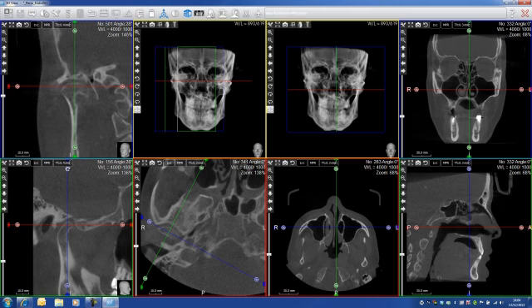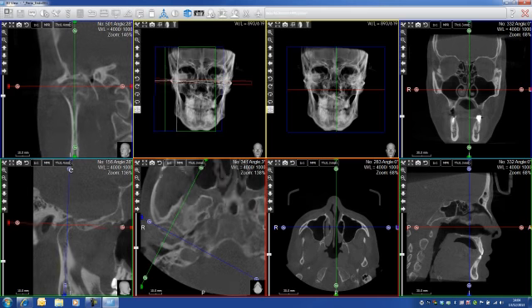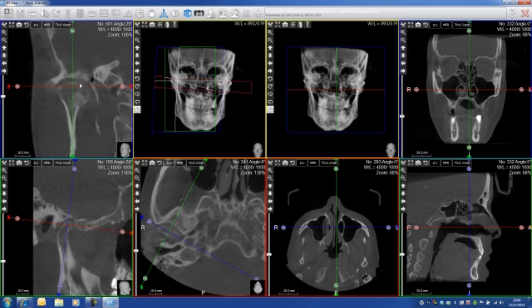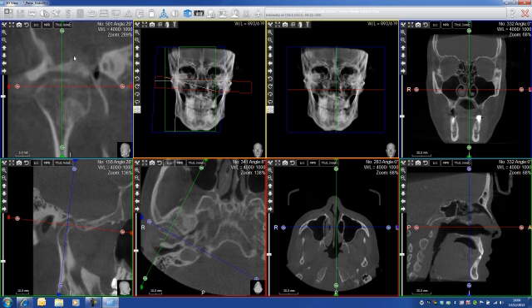I can angulate this view a little bit, and then I can see the joints between the condyles.